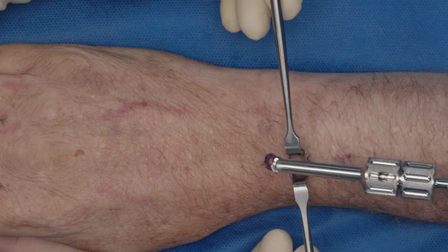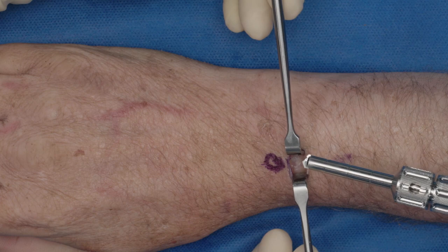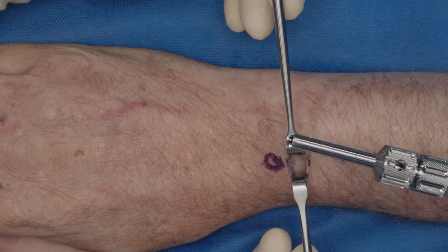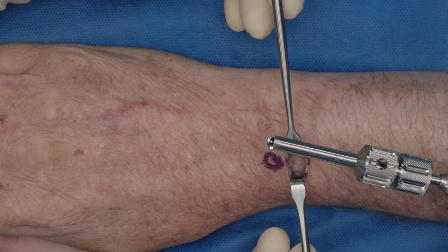We are going to be using the 6mm OsteoAuger. Once you're down to bone, make sure the tendons are out of the way. For the radius, we often start off the bone because sometimes it can skive. For the OsteoAuger, you do not need to start with a pilot hole — you can if you would like to, but it is certainly not needed.